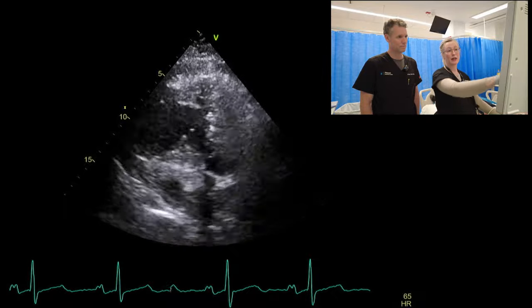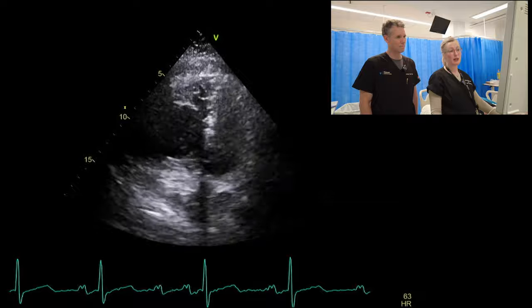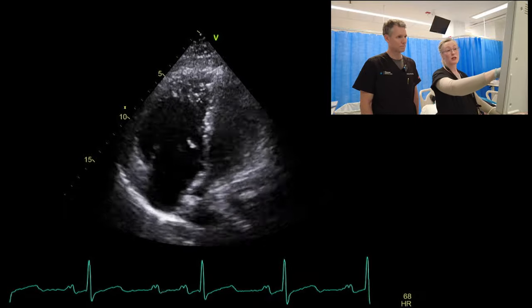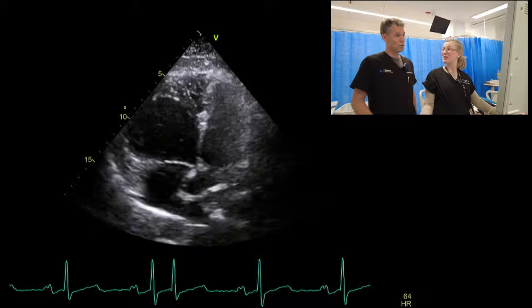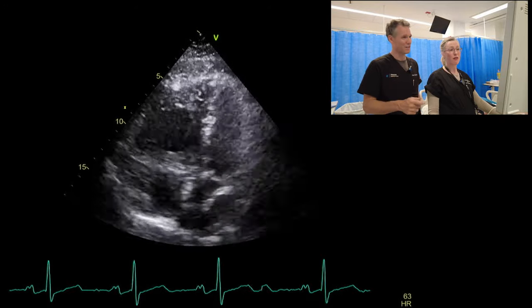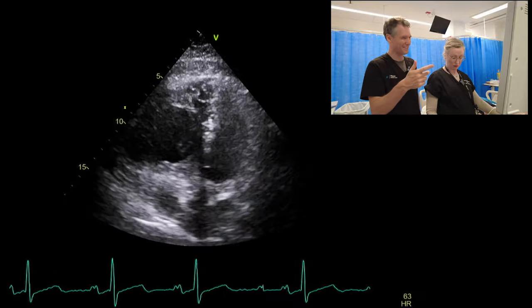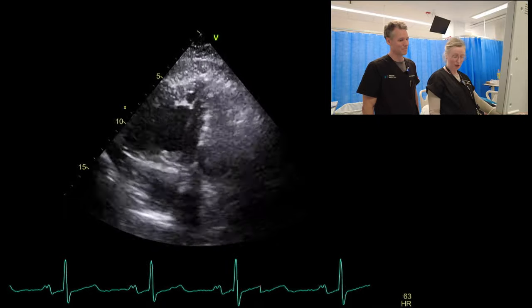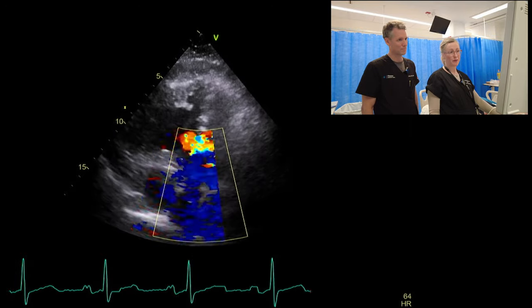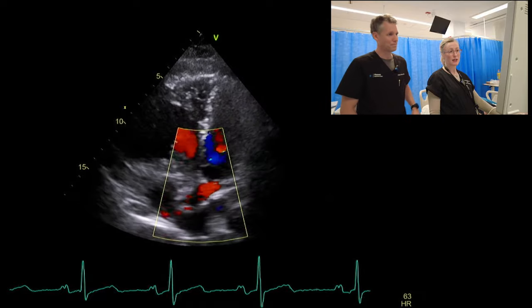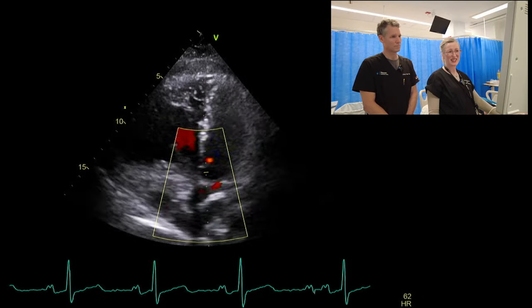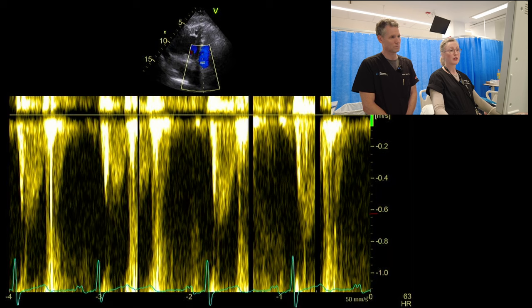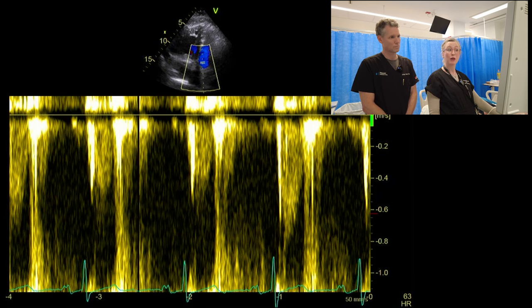We can then try and get our pulmonic outflow tract and assess here with pulse wave Doppler, measuring acceleration time and looking for evidence of pulmonary hypertension. We can also use the MR jet to estimate pulmonary pressure just as we would with the TR jet. Tilting up to get the pulmonic valve view, popping some colour on, we can see a little bit of PR probably just coming back there. Trying to line up as best we can with pulse wave Doppler and looking for that closing click — being careful not to be too close to the valve.